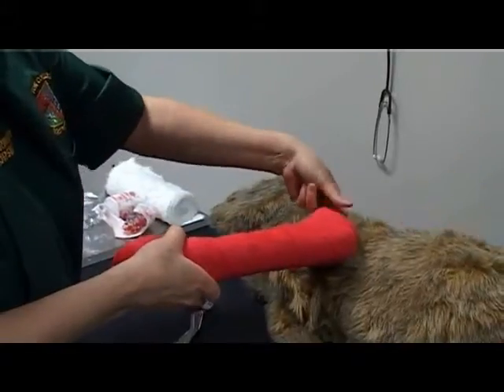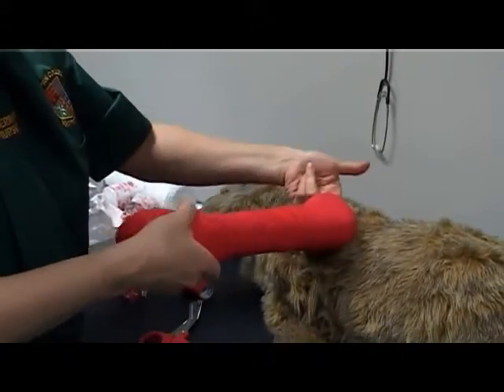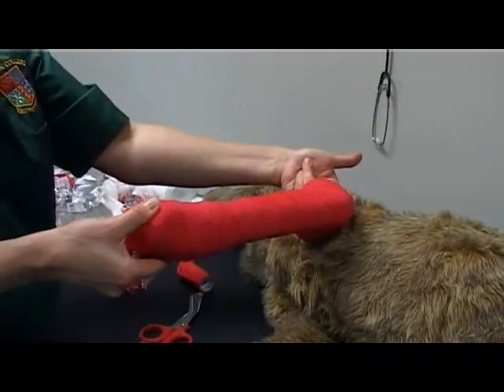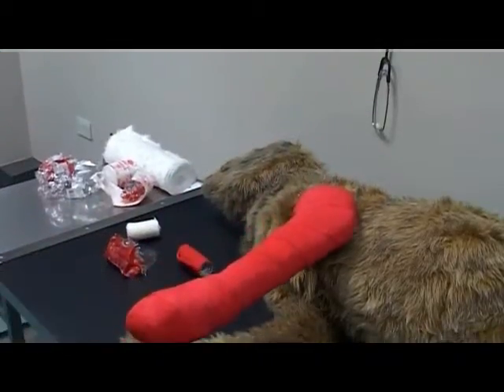Use two fingers to check the tension at the top. Check the bandage is neat and no pieces of padding or bandage material is showing.